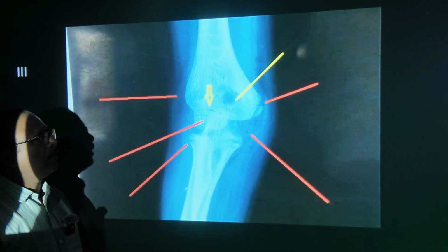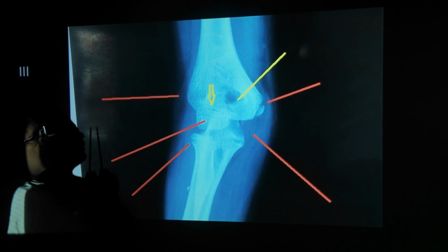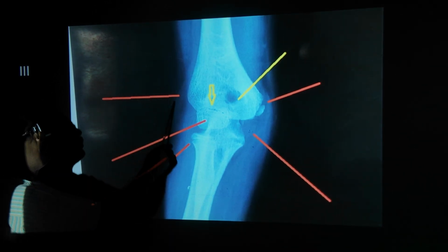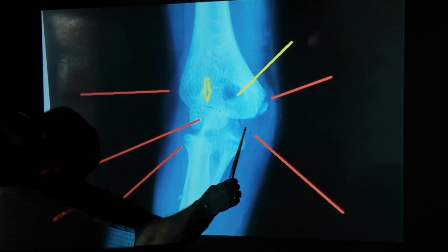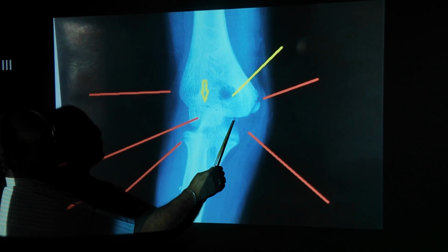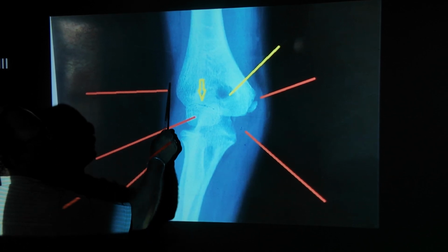Dear students, today's class is ossification centers of the elbow joint: lower end of humerus, upper end of ulna, upper end of radius. Lower end of humerus contains four centers: medial epicondyle, trochlea, capitulum, lateral epicondyle. Capitulum is visible here, appeared but not fused. Trochlea, not yet formed. Medial epicondyle, formed. Lateral epicondyle, not formed.